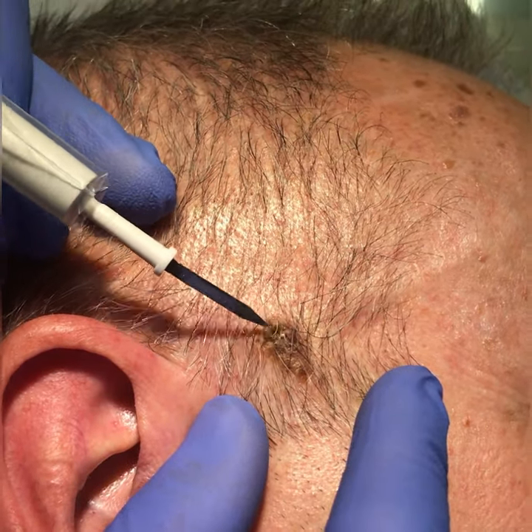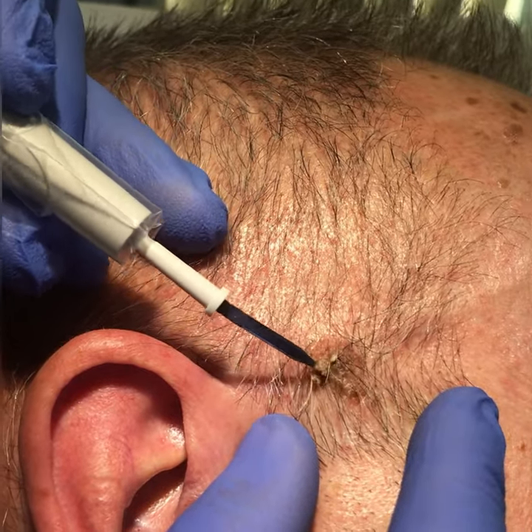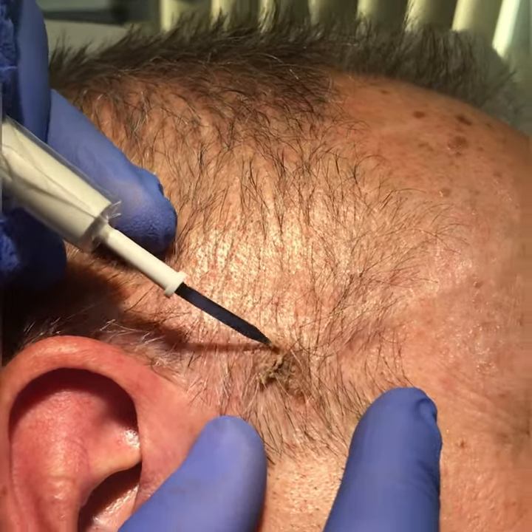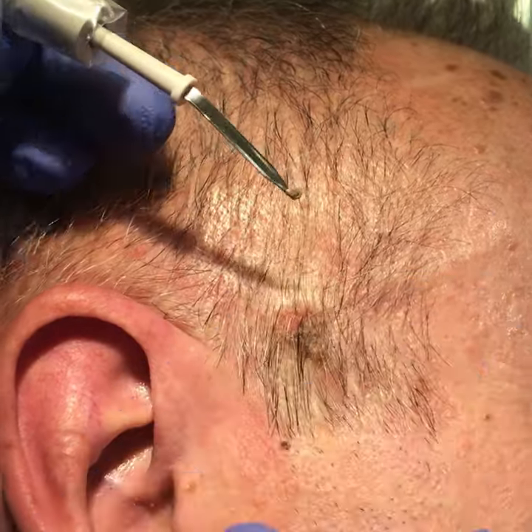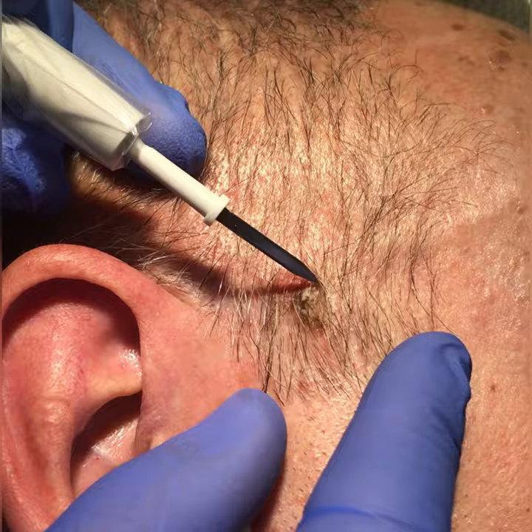Here we have a wart on a gentleman's scalp. These are often seborrheic keratosis — they're completely benign and harmless, but they do get irritating as we get a bit older, and they often dry and flake and scab a little bit.